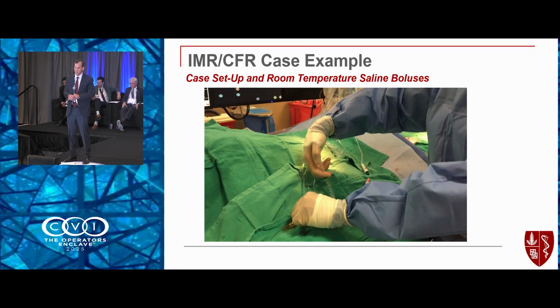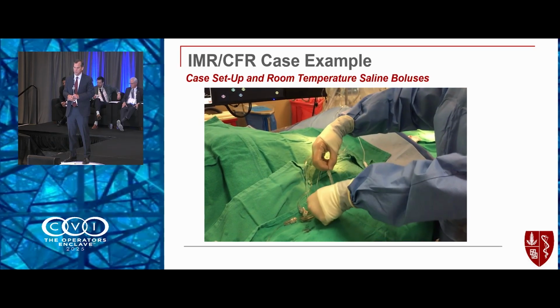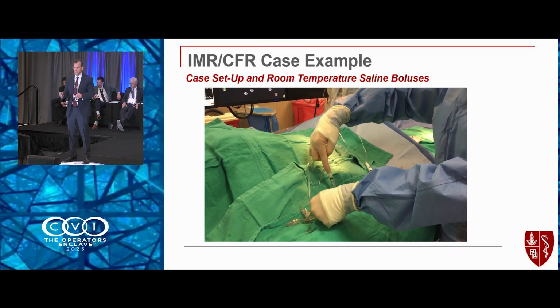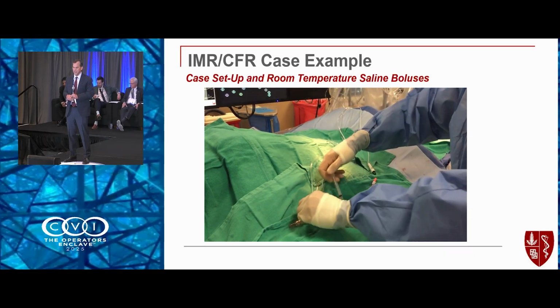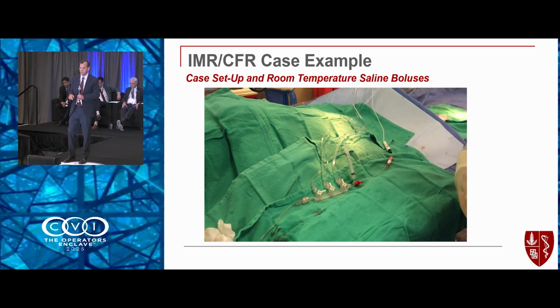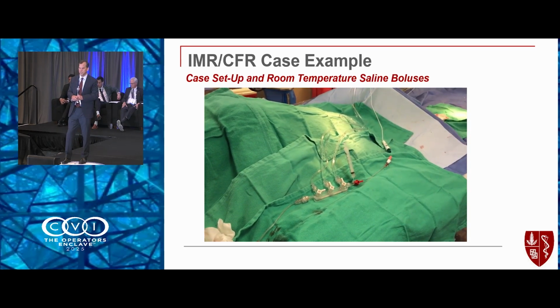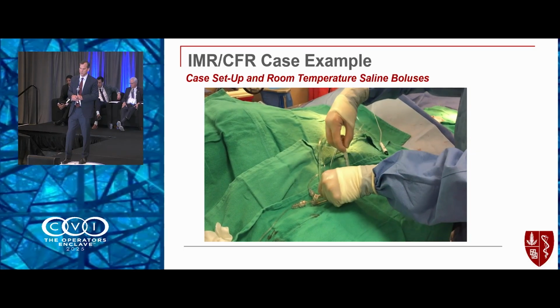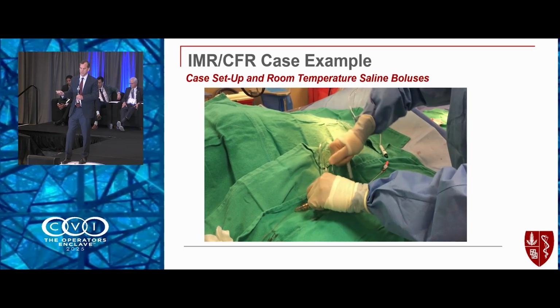This will just show you how we first flush with saline just to clear the guide catheter, and then you give it a few seconds to settle, and then you press start for your resting measurements, and you go ahead and do a resting measurement. This gives you an idea of the briskness of the injection that we use. And you see that this is very quick.